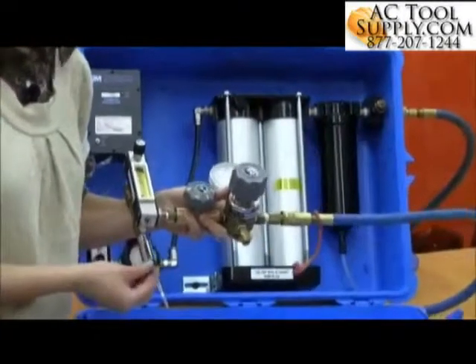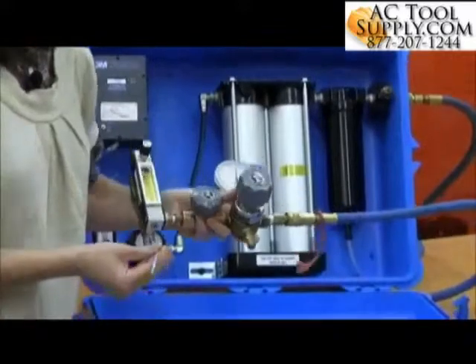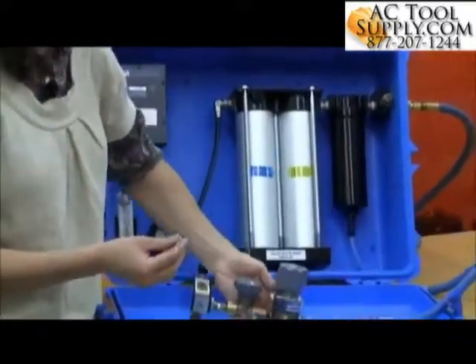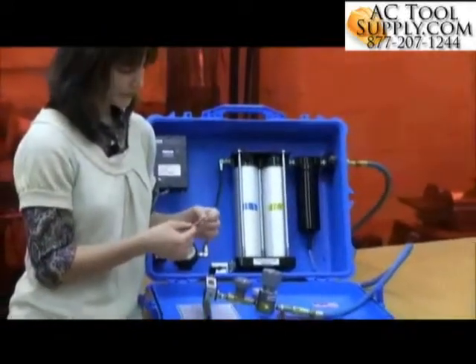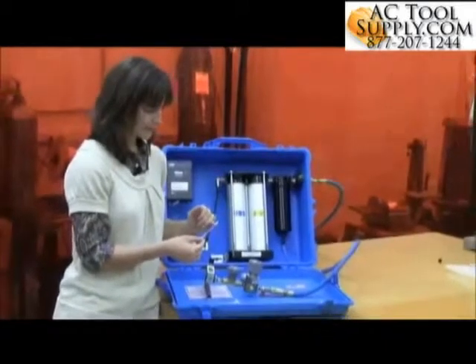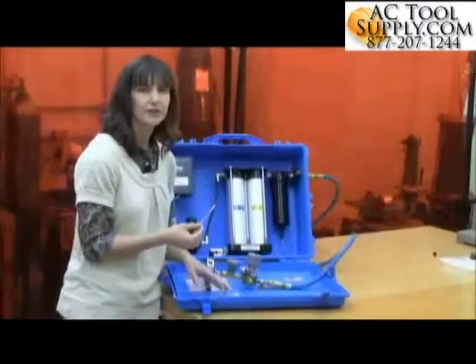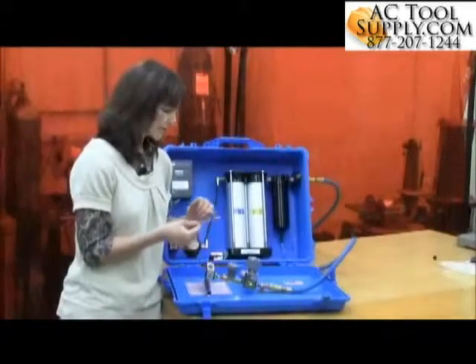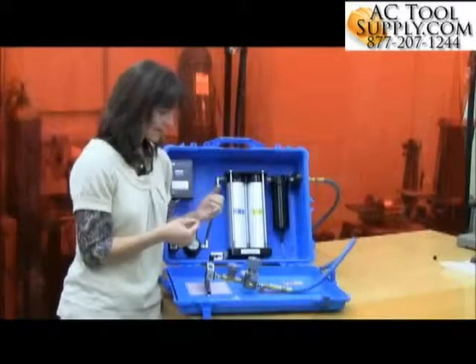When you've met that testing time, pull out the tube and read to see if you've got a color change. For this particular tube, I'm testing for carbon dioxide. The initial color is purple, and per the user instructions the color changes to a light pink. I'll look and see if I have any light pink color change — and I don't.